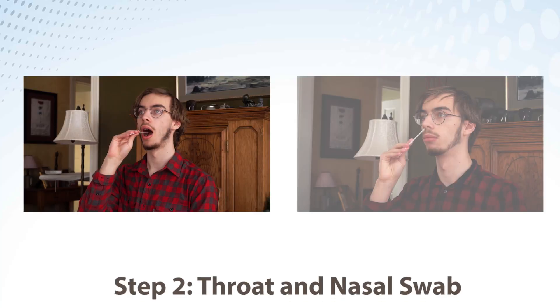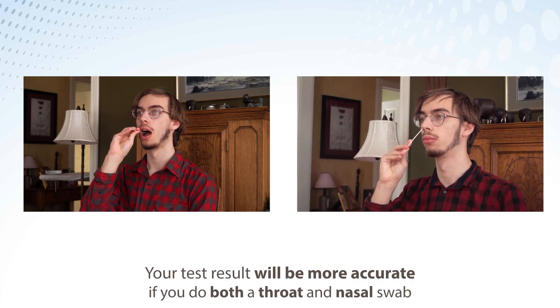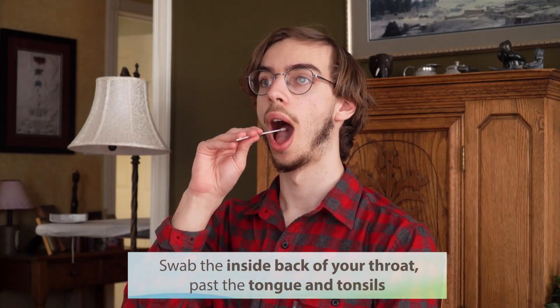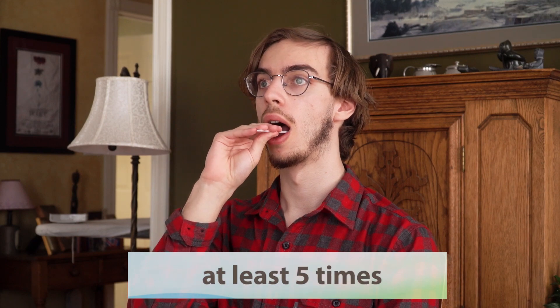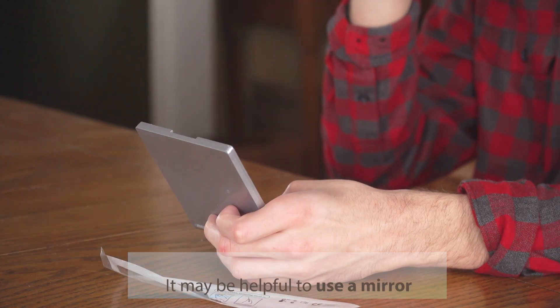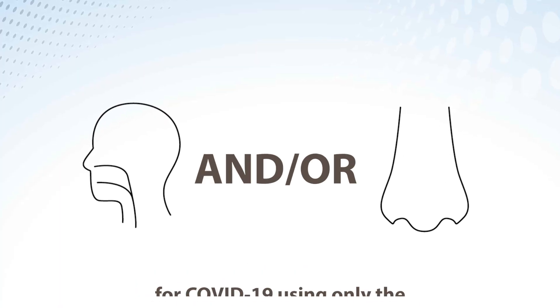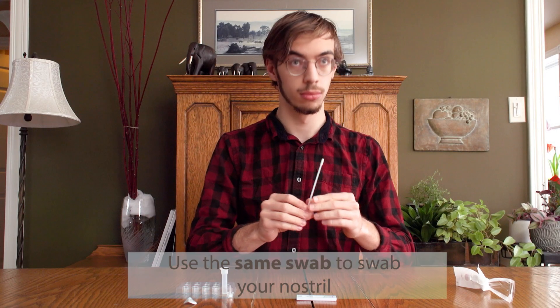Step 2: Throat and Nasal Swab. Your test result will be more accurate if you do both a throat and nasal swab. Swab the inside back of your throat, past the tongue and tonsils, at least five times. It may be helpful to use a mirror for this step. If you can't do the throat swab, it's still good to screen for COVID-19 using only the nose swab.